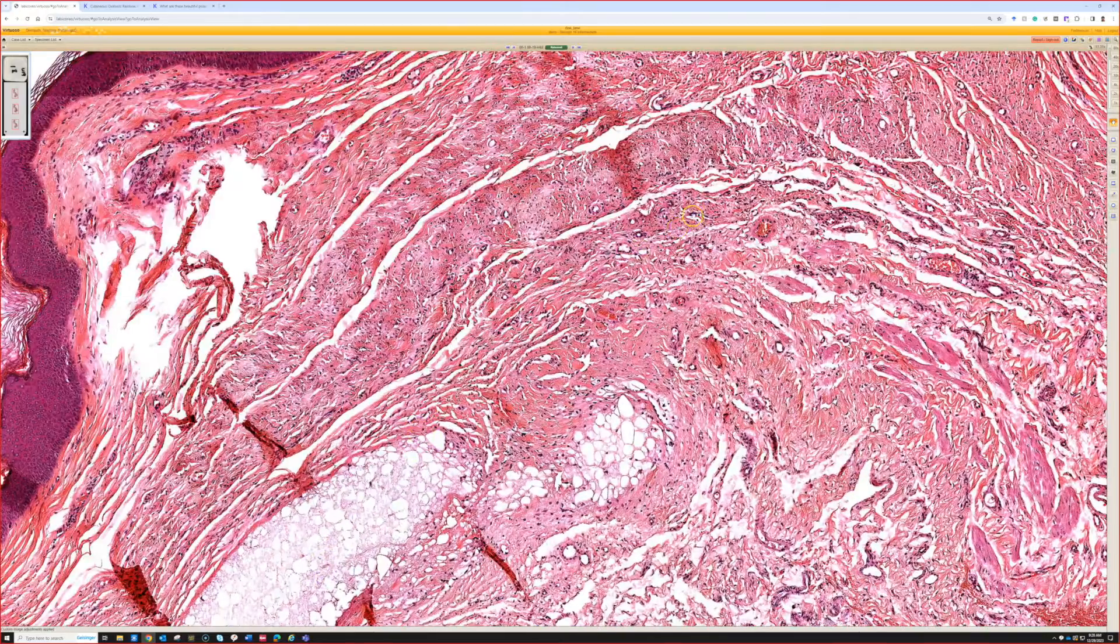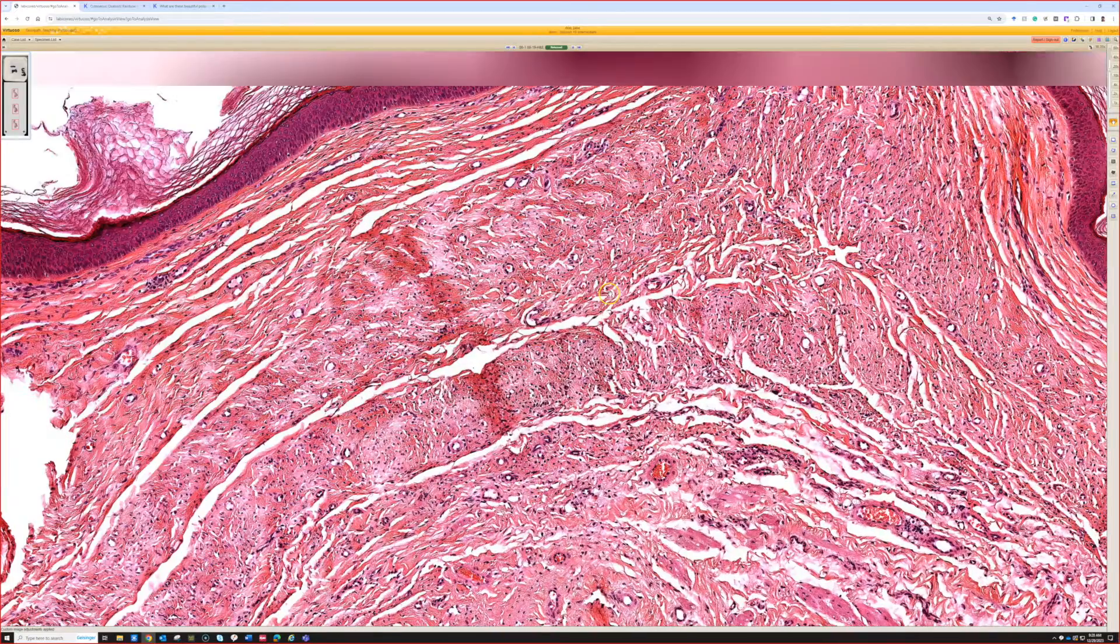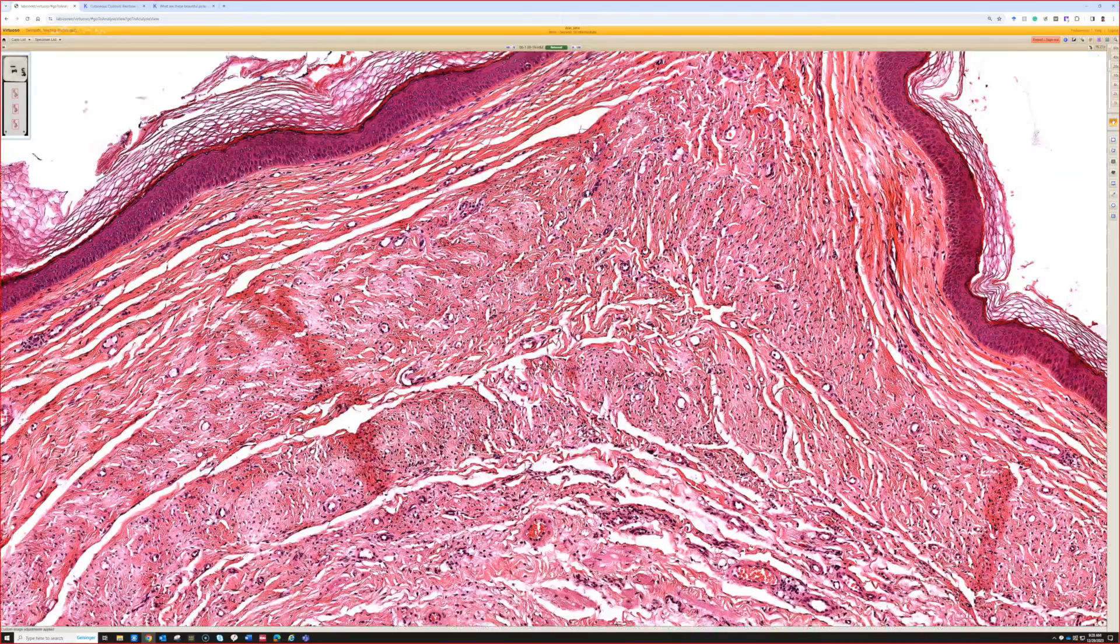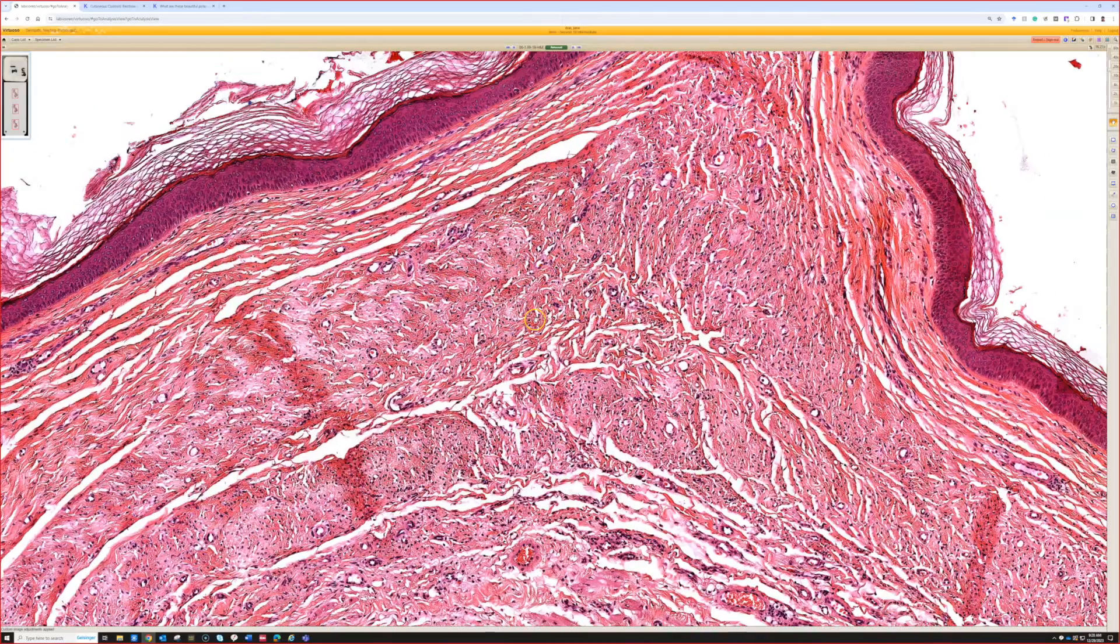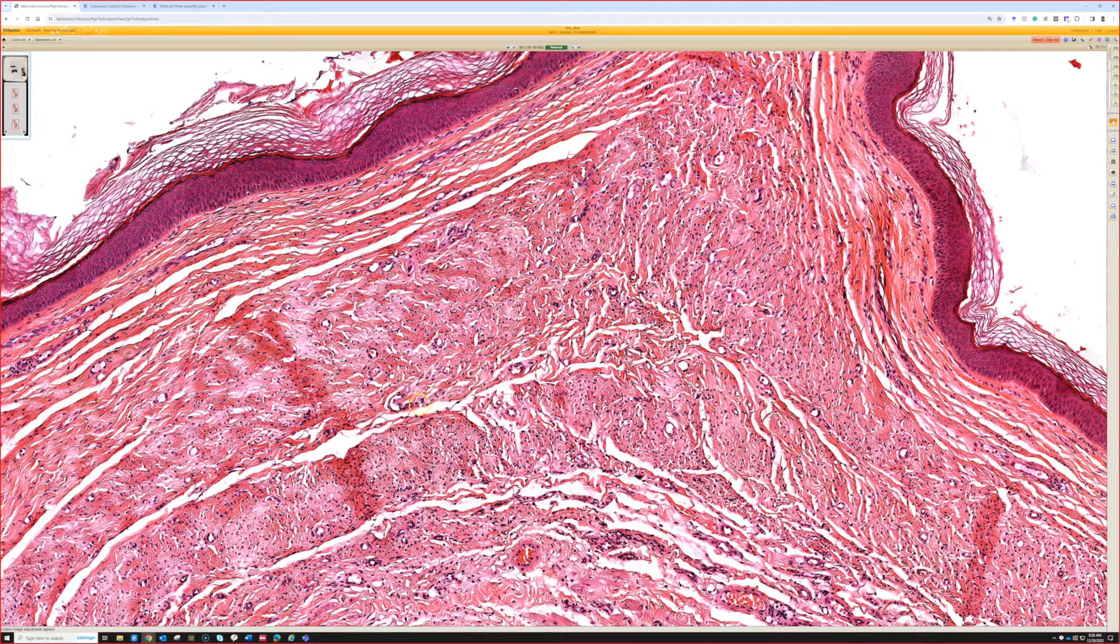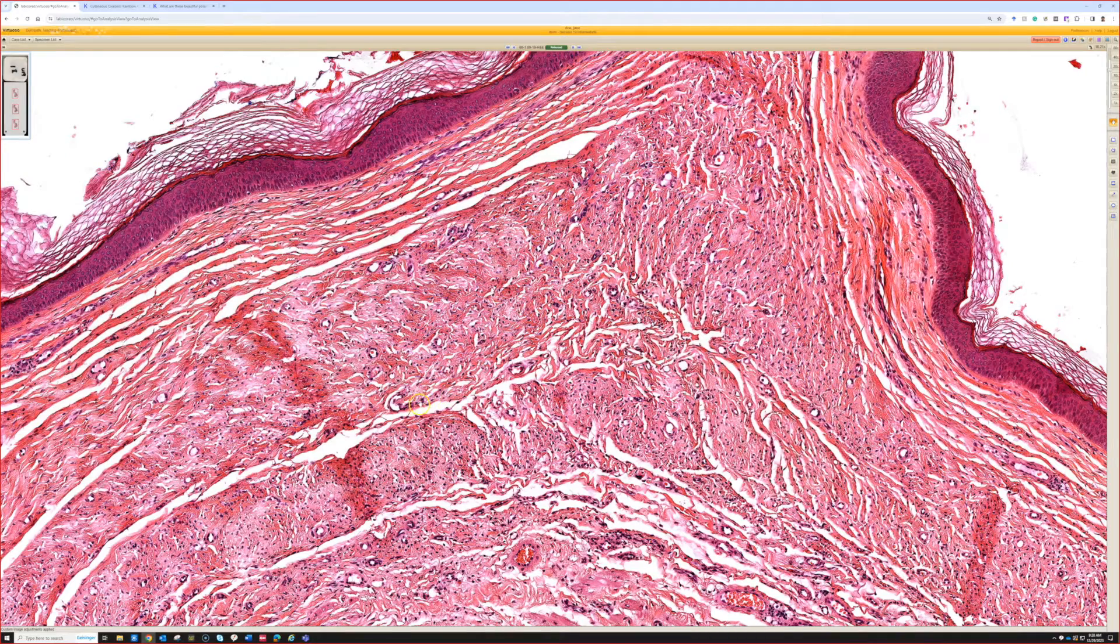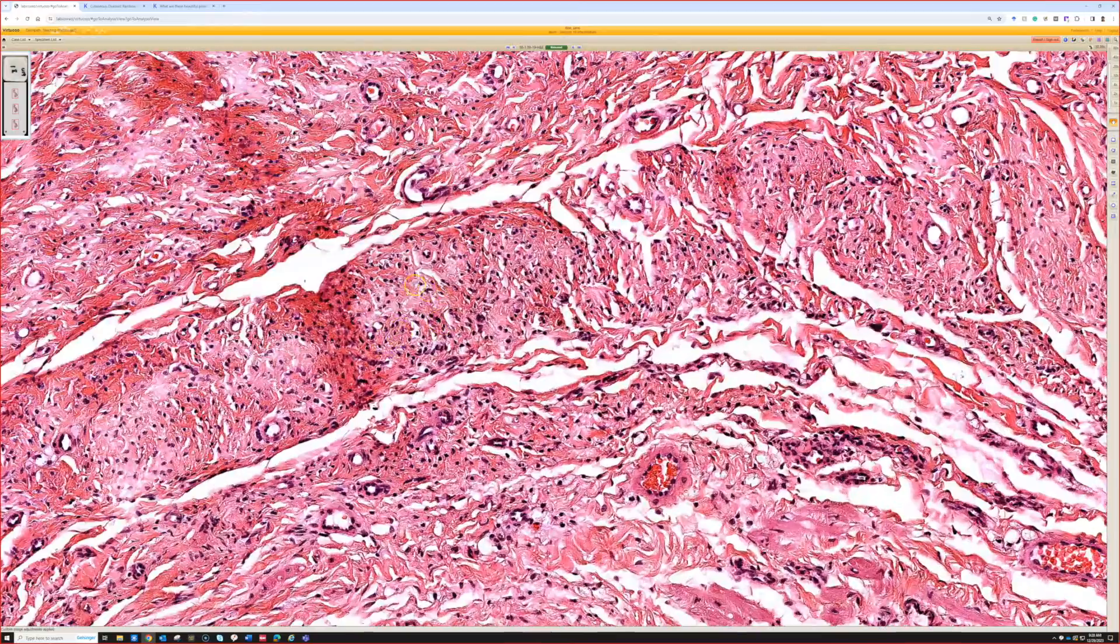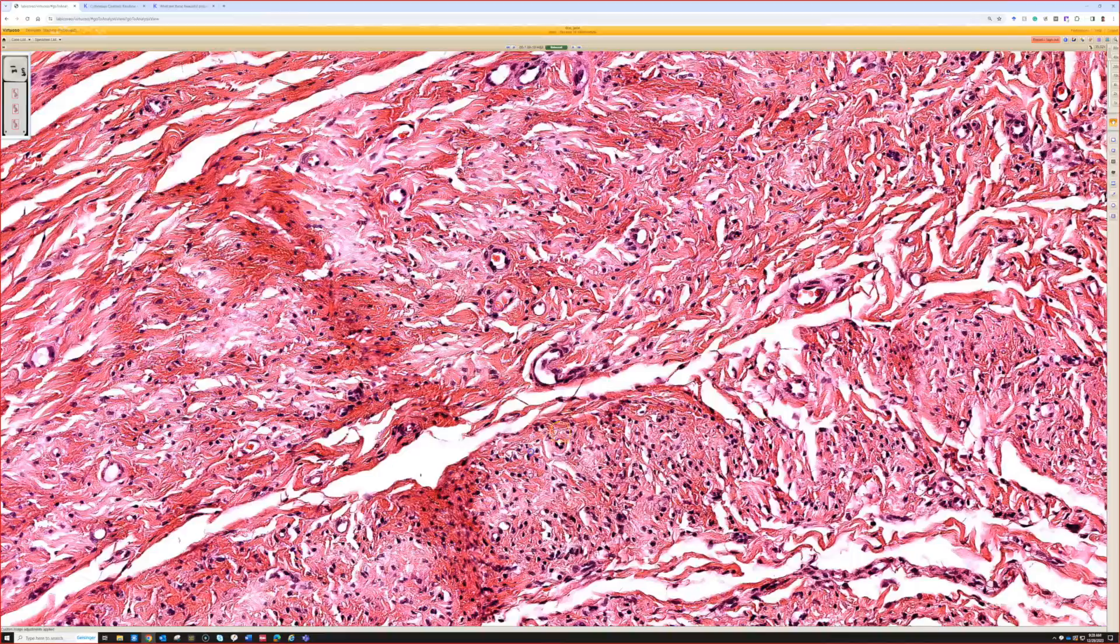So the background is a very dense scar. This is old, mature scar. I don't know how old, but it's so dense and pink. And it doesn't look like parallel fibroblasts here because we're cutting them in cross-section. They're actually coming out of the screen at us. That's why they look round.